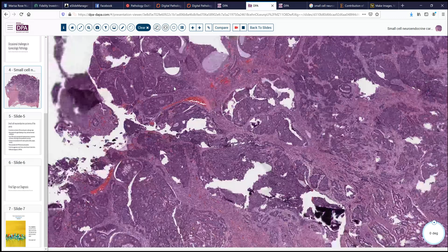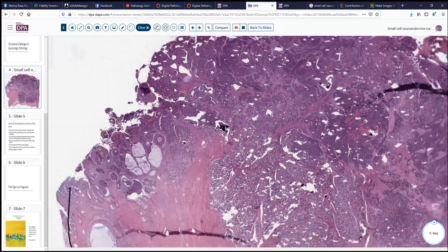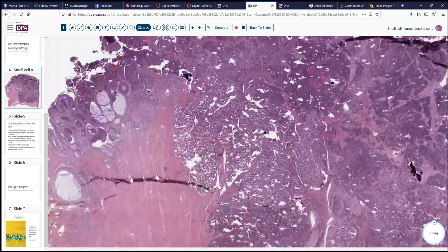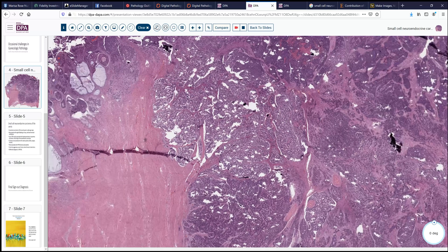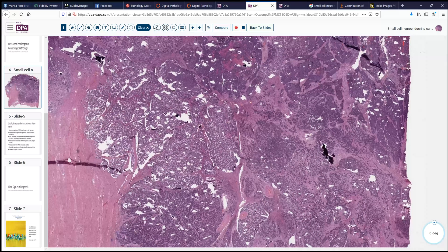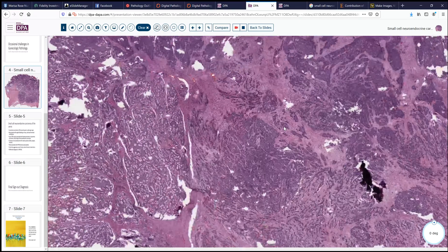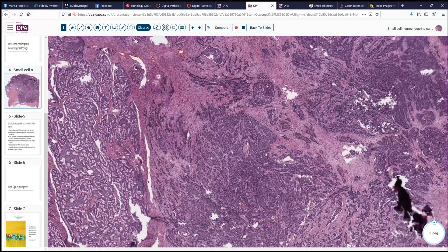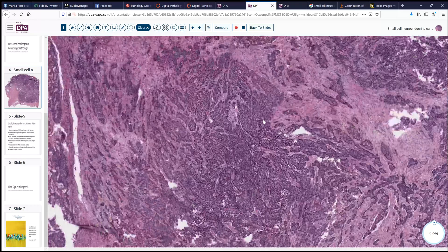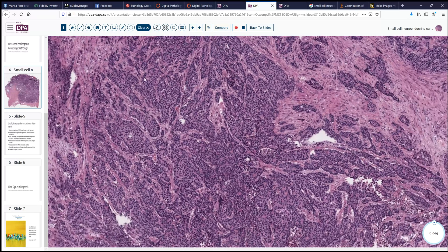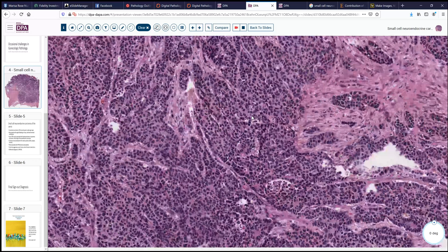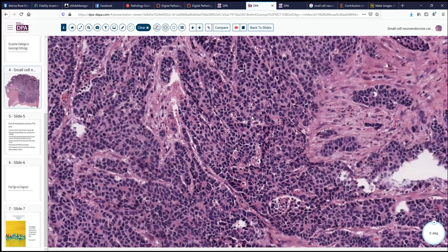Let's step back again and look at the overall architecture. Here we see more of a corded and trabecular pattern without prominent glands, and here a more solid pattern without evident glandular spaces. Looking over here, this is again a more trabecular, infiltrative nesting pattern with very poorly formed, if any, glandular differentiation.